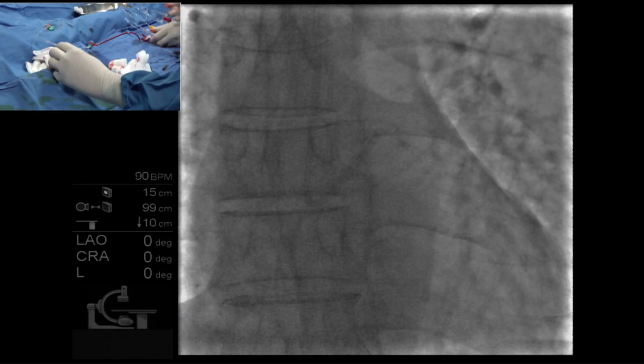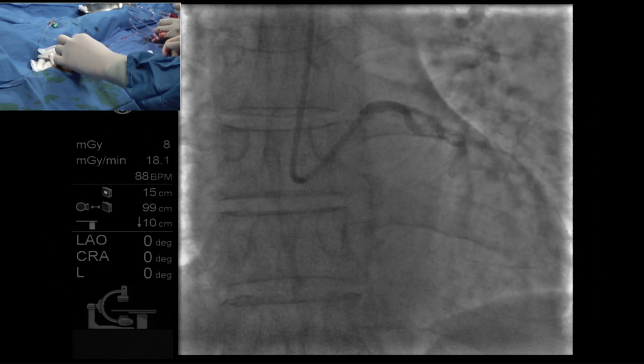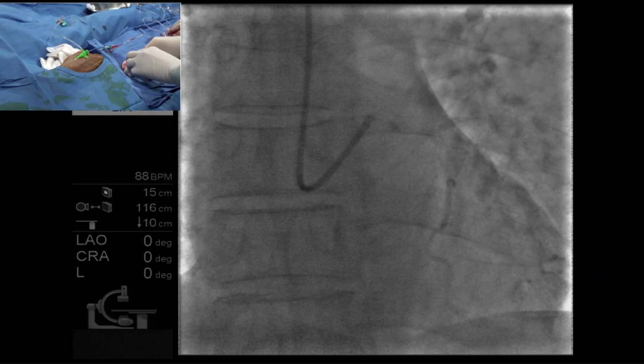Okay, good. Pressure okay? Yeah. Okay, good. Give a test. No, you've taken a JL, please. This is for EBU. EBU 3.5. Can I have the run-through wire?